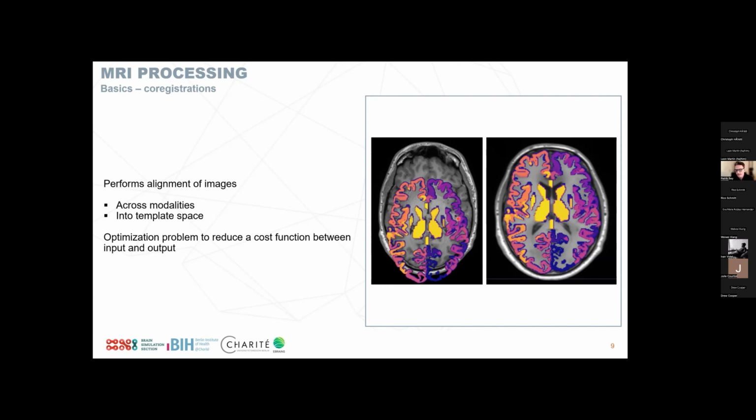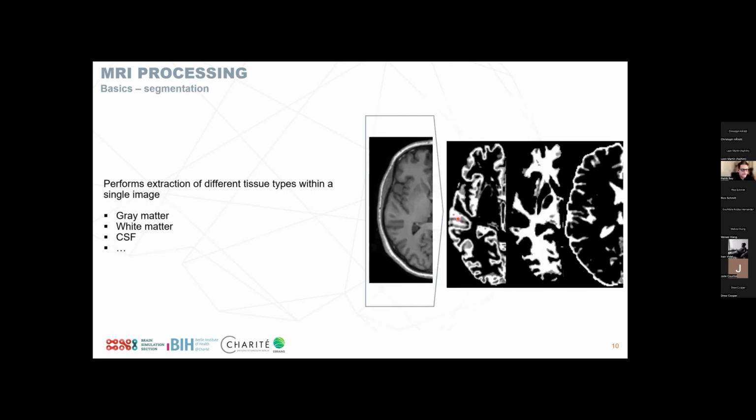But we want to minimize this cost basically. So we want to solve this optimization problem to have those aligned. We will get to this basic property several times throughout the talk today, I think. The other one, one of the basic ones, is segmentation.